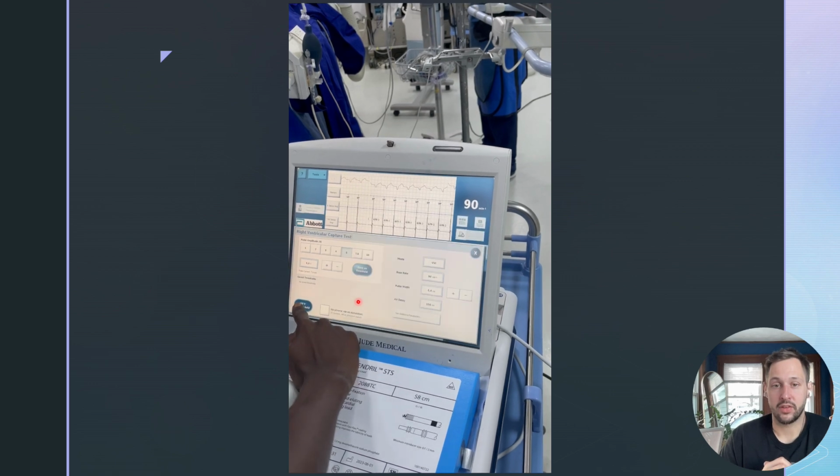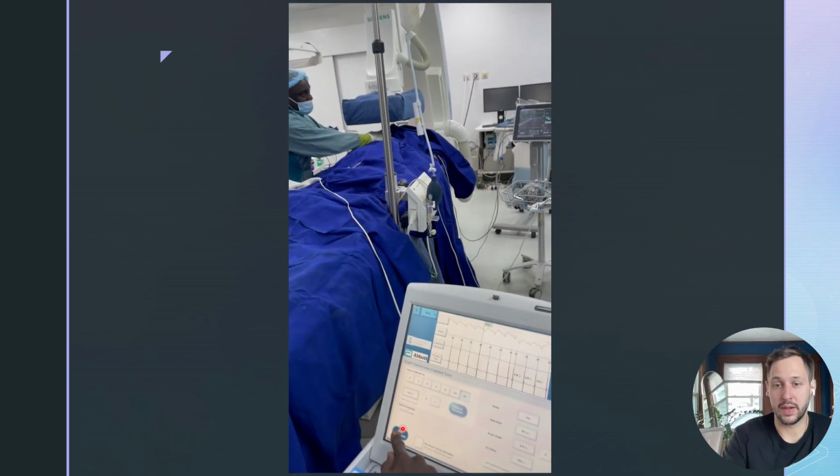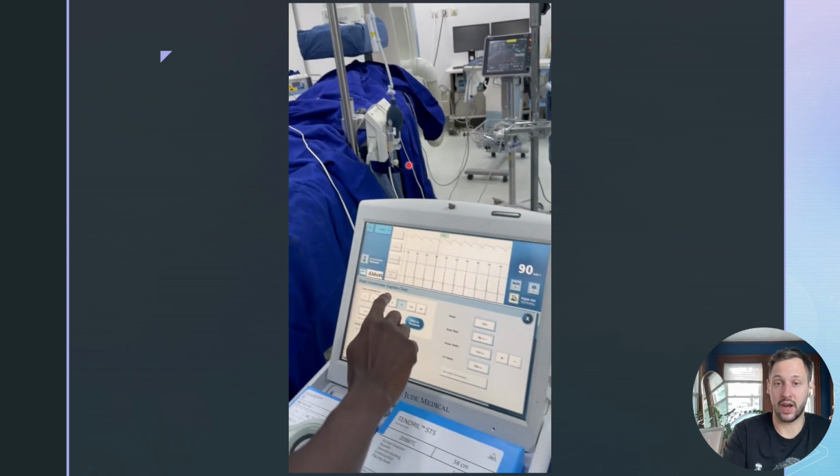He's going to run the 10 test volts, and goes straight to 10 volts. When you hit this little 10 volt button here, it kicks it up to 10 volts at 1.5 milliseconds. That increases the amplitude, trying the best to ensure diaphragmatic stimulation if it's possible. You want to see if it's possible with this lead placement to stimulate the phrenic nerve, PNS. If you have that, that could cause a hiccuping sensation, which is not ideal for patients. Better to locate it now while you're placing the lead. Physician feels nothing at the diaphragm.